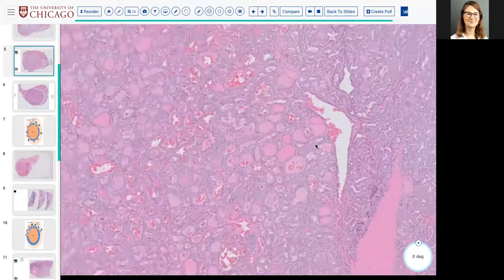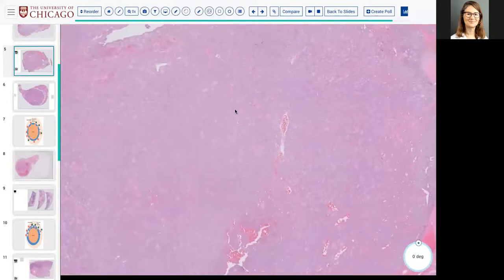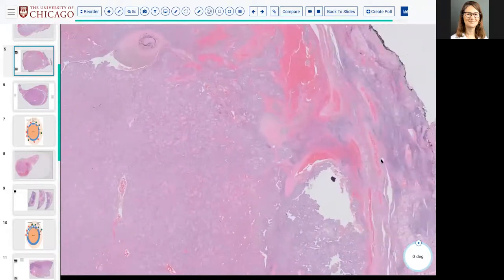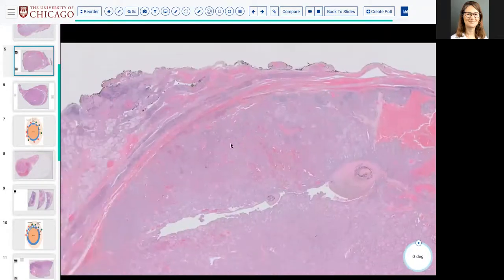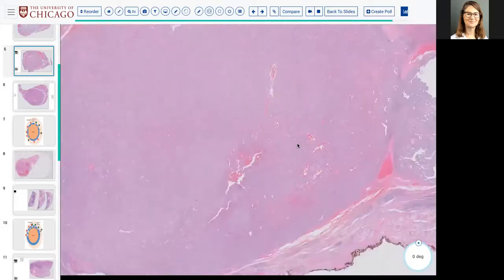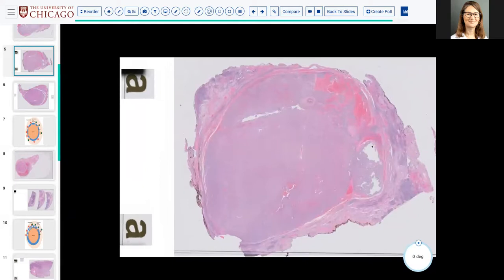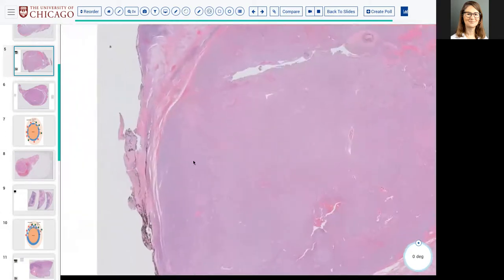All right, I'm going to do a BRAF immunostain on this case because that's our protocol, and it's negative. So then what do you want to do? Are you good calling it PTC, or do you want to step back and call it a NIFT-P? Do you want to do molecular? We have a vote for PTC. We have a vote for invasion. So it looks like you guys are leaning towards PTC, or you may want to do molecular.